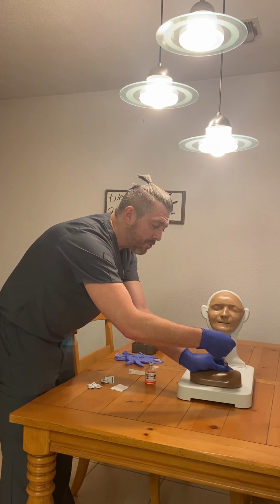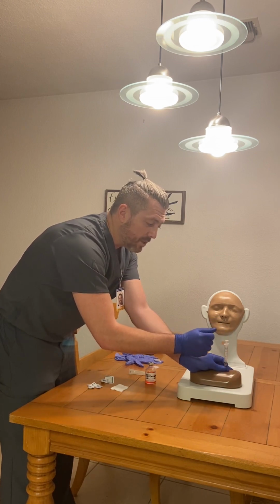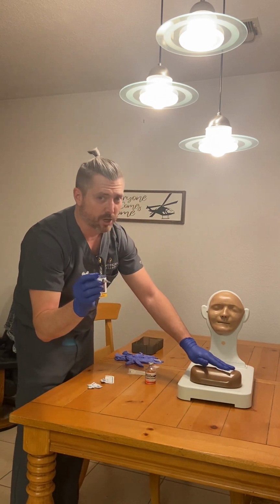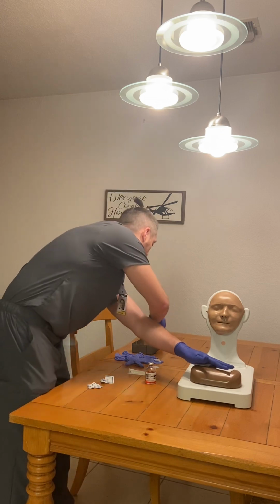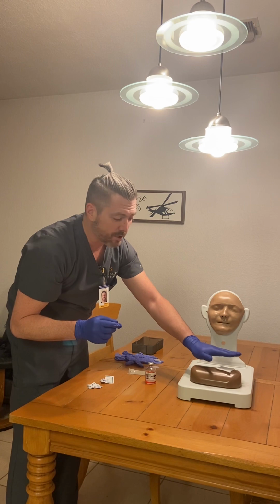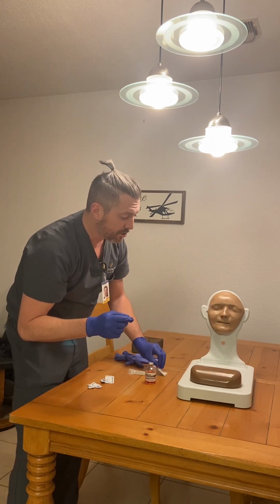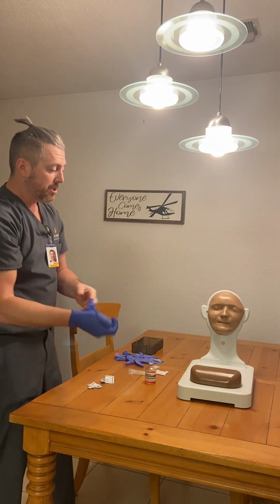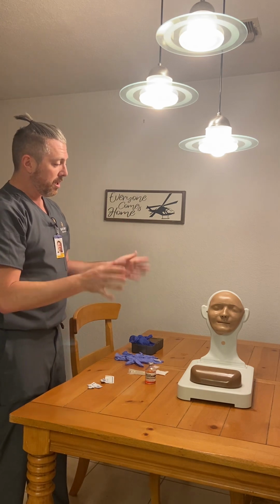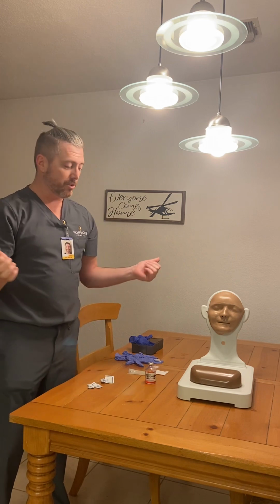After 10 seconds is up, we're going to keep it in there for another 10 seconds. 1, 2, 3, 4, 5, 6, 7, 8, 9, 10. And we're going to remove and put the gauze over. We're not going to massage or hold anything. The needle immediately goes into our sharps container. Again, no pressure, no massaging. We're looking to make sure there's no bleeding. There's no bleeding. It looks good. We're going to remove our gloves, perform hand hygiene, clean up our stuff, make sure the patient is comfortable and in a comfortable position with their call light, and document what we've done. And voila, we have done an intramuscular injection.